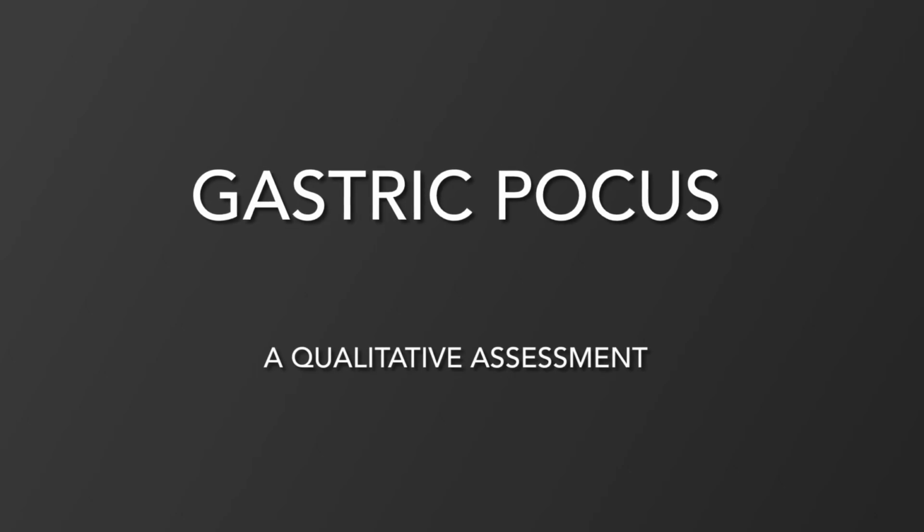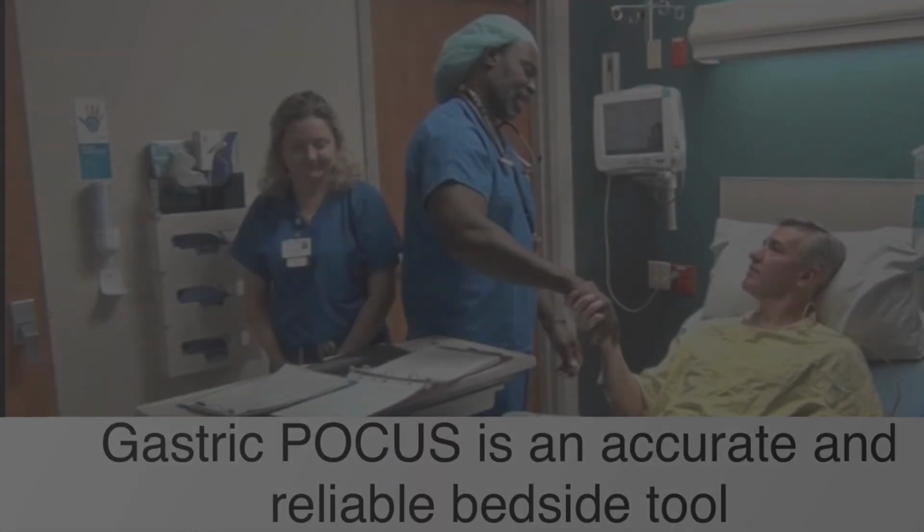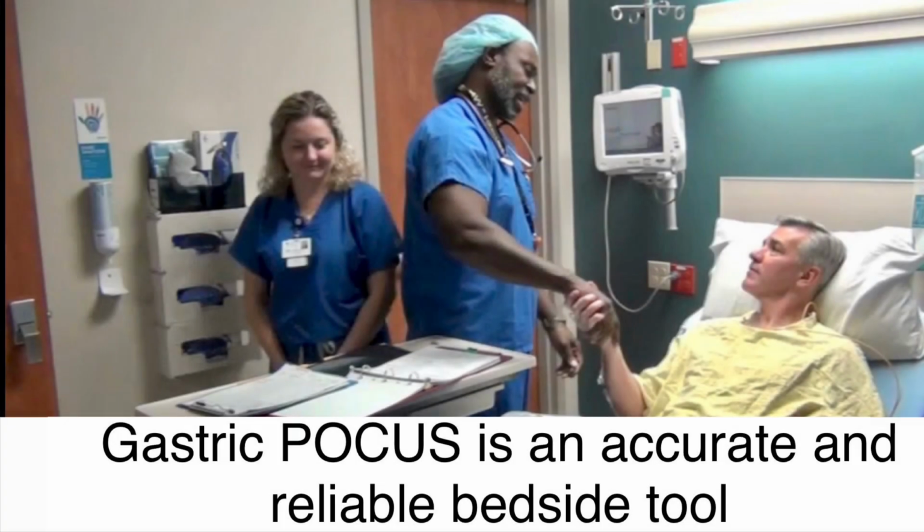Okay, Larissa, what are we going to talk about today? Gastric POCUS. What does POCUS stand for? Point of care ultrasound. Excellent. Point of care ultrasound is just an easy bedside tool to look at stomach contents in situations where NPO status is questionable. Okay, give me an example. People on Ozempic.